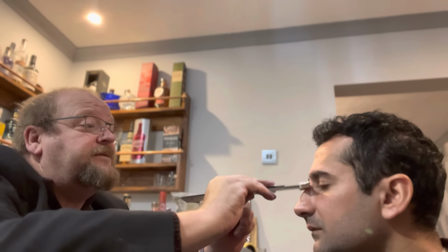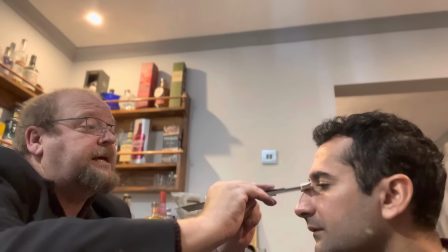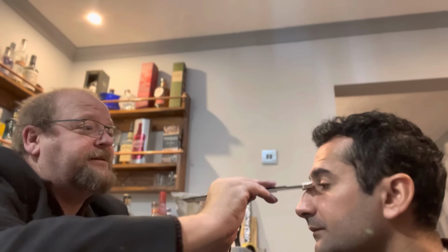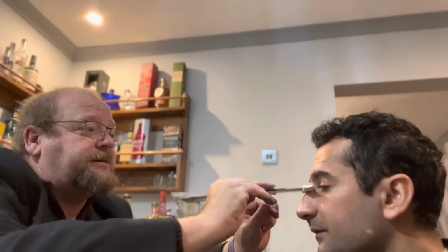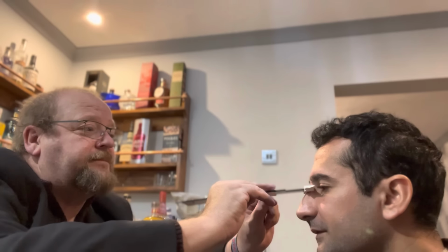If you want to blink for me a few times, can you feel that? No. Open your eyes wider and blink. You can't feel that at all? No. That's all right. Just a little fraction further. There, you can. Is that better? Just missing, I think. Yeah. So as I measure that, we can see that it's just on that second line there. So that's 15.